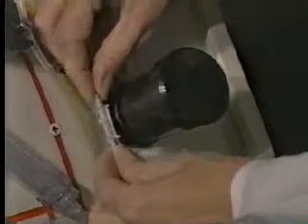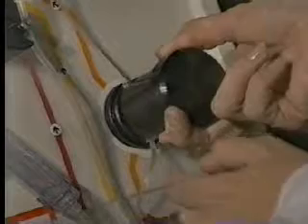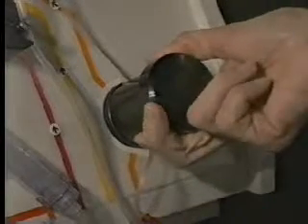Pull the housing out and turn it counterclockwise to lock it in the load position. While holding the ends of the cuvette with a flat side parallel to the front panel, slide the cuvette into position in the monitor. Turn the housing clockwise and lower it over the cuvette.